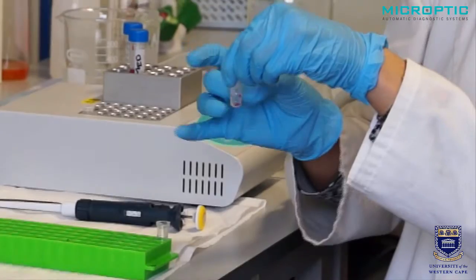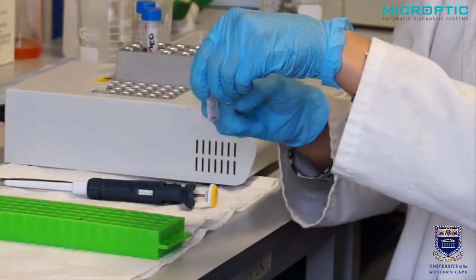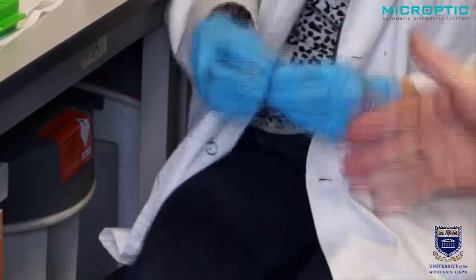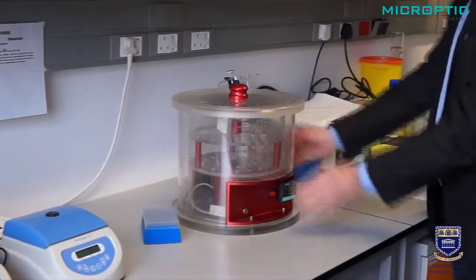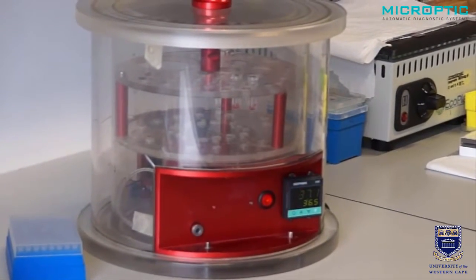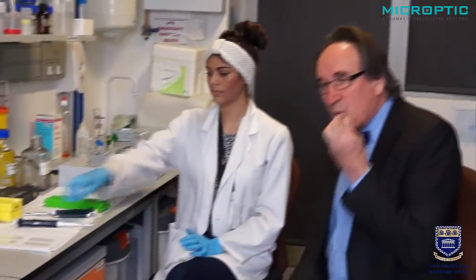Mix the sample well, which is now a mixture of capacitating medium and semen at a dilution of ten times. This now needs to be incubated in an incubator for about three hours, done at 37 degrees centigrade.